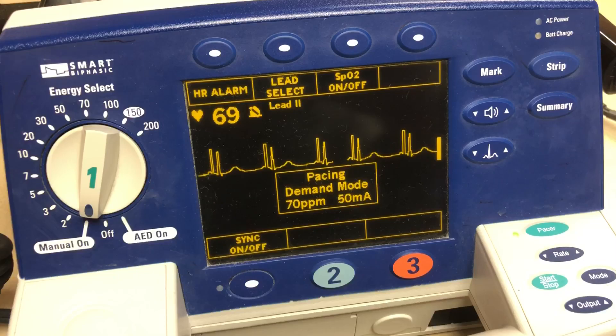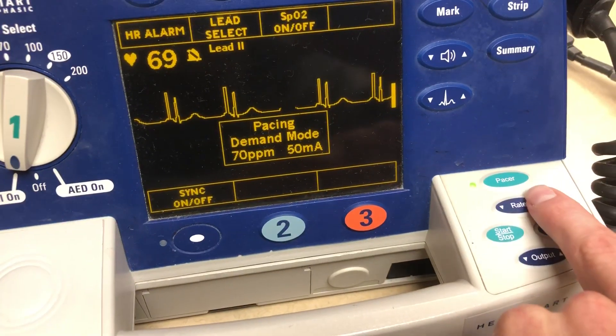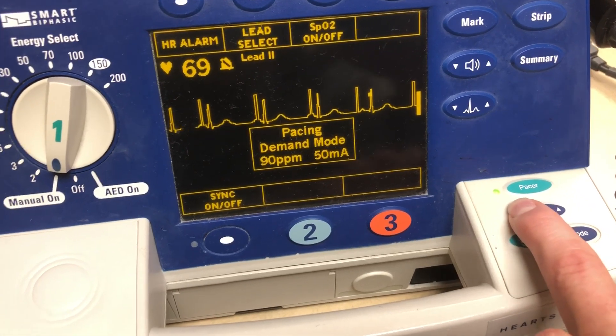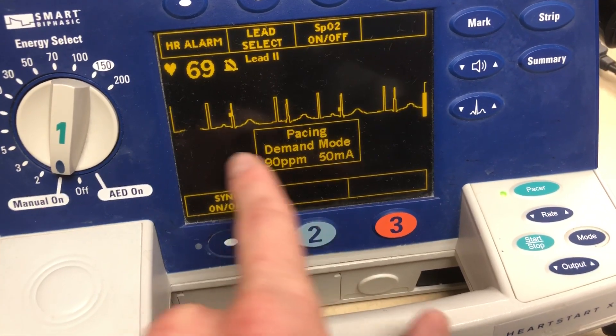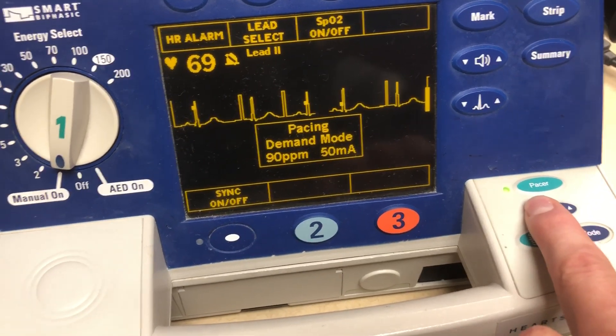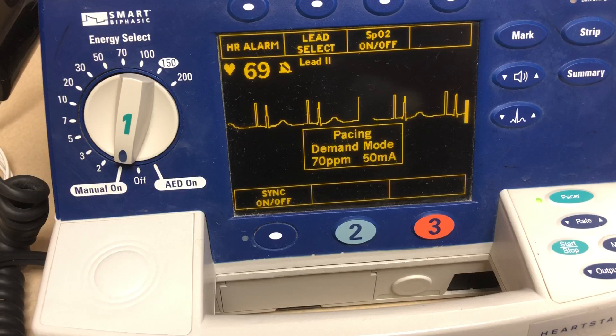Now the doctor says, hey, can we up their rate? I want their heart rate to be 90. You're going to come over here to rate and crank that up to 90. We're not going to capture because of course this is a fake patient. So those are the two ways that you're going to pace somebody.